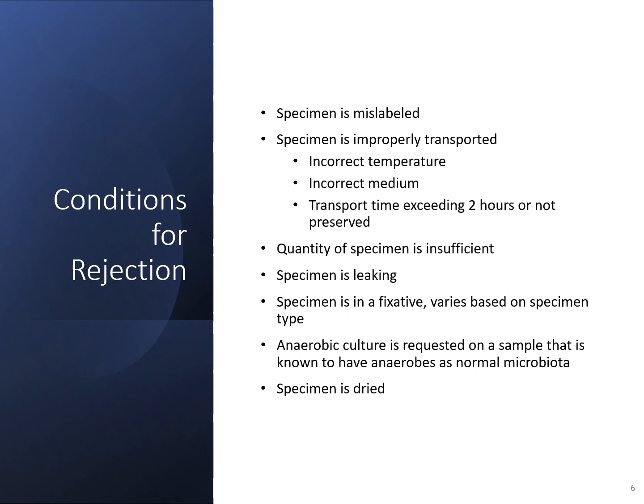If it's not properly transported, so if it was stored at the wrong temperature, collected with the wrong swab, or put in the wrong collection media, or if it got lost in the courier's car overnight and has been sitting in the hot car for 24, 48 hours, then that specimen obviously couldn't be cultured, because those organisms would either have a lot of overgrowth, or depending on the temperature, it could have destroyed those organisms and it could have dried out.